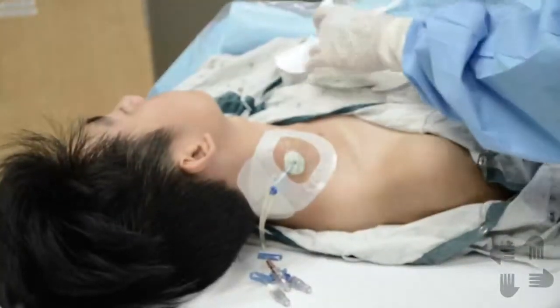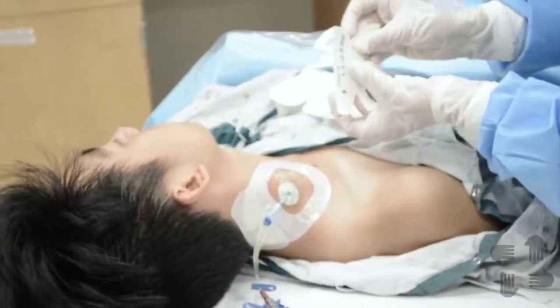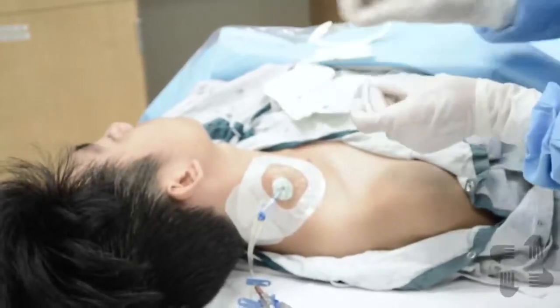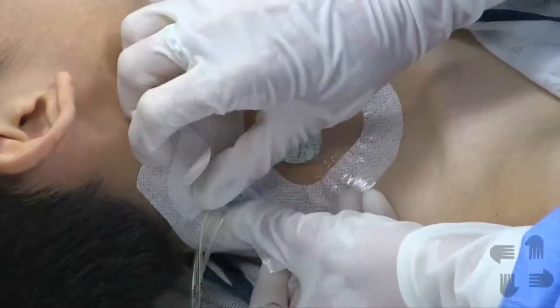And next you're going to take your dated dressing that has the date that it was inserted and the date that it is due for the dressing change last. And you're going to place this over the remaining blue part of the catheter, like that.